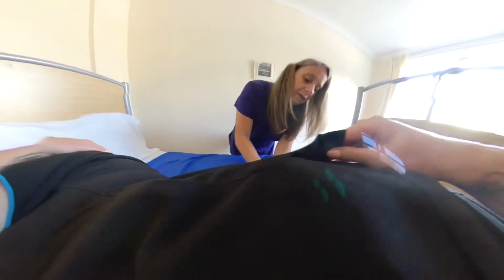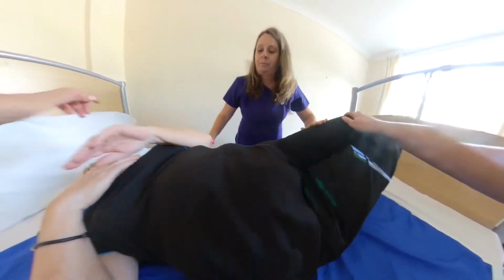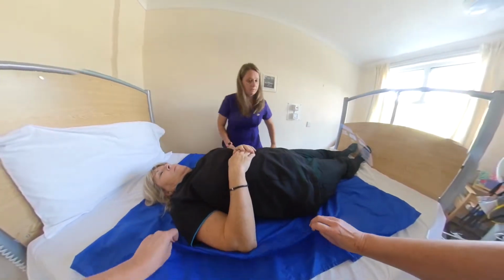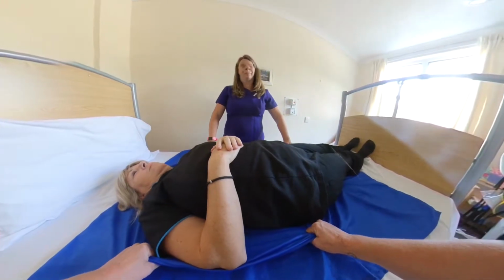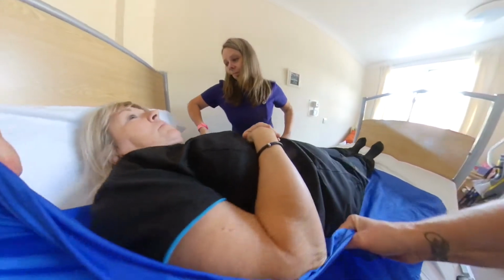Smooth out the slide sheet, ensuring that there are no creases that might pinch or rub on the service user's skin. Once smoothed out, roll the service user onto their back. On the command ready, steady, slide the service user into position.